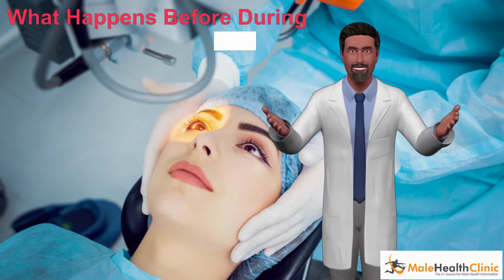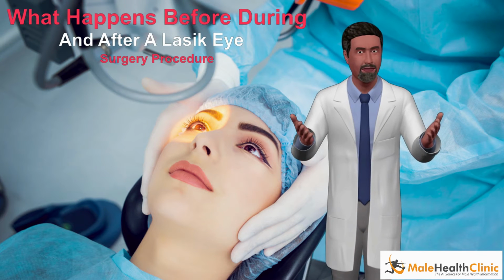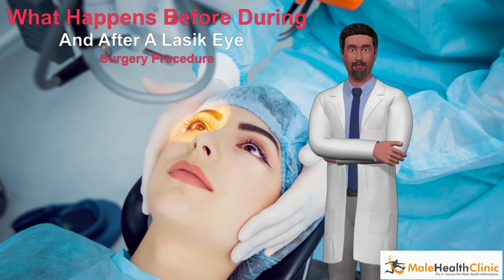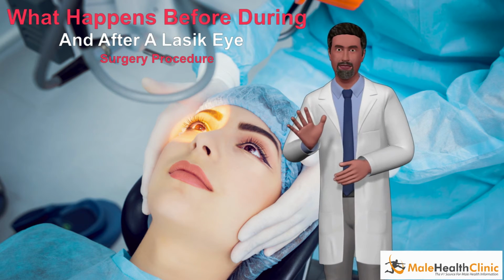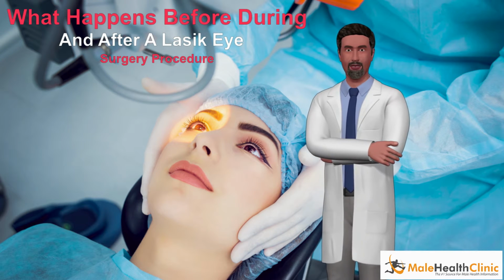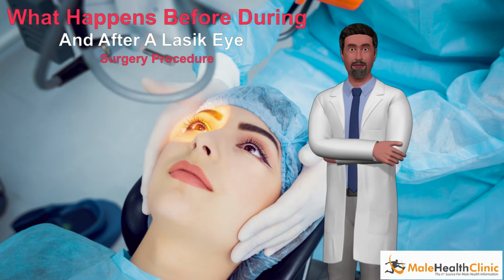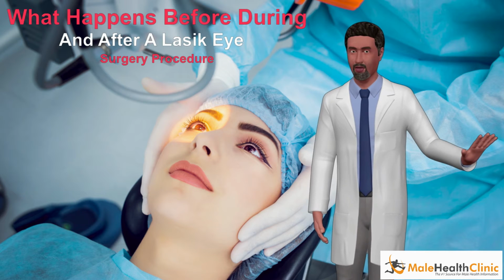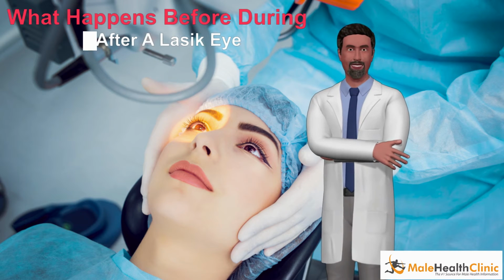Since LASIK was approved by the FDA in the early 1990s, the procedure has grown to become the most widely performed eye surgery in the United States. LASIK is a surgical procedure performed on the eye to correct an individual's vision and reduce dependency on eyeglasses or contact lenses. LASIK stands for Laser-Assisted In-Situ Keratomileusis, which literally means to reshape the cornea from within using a laser.